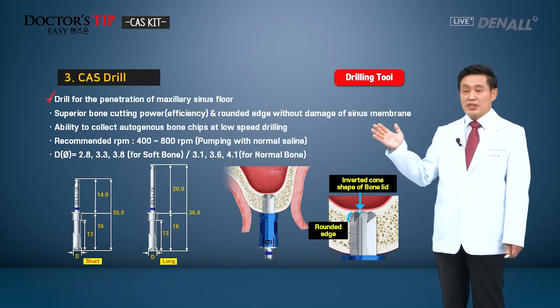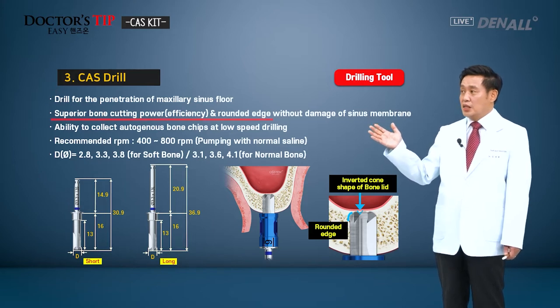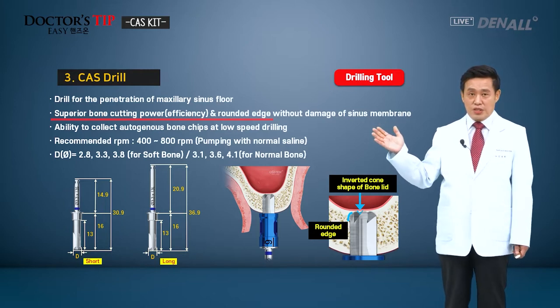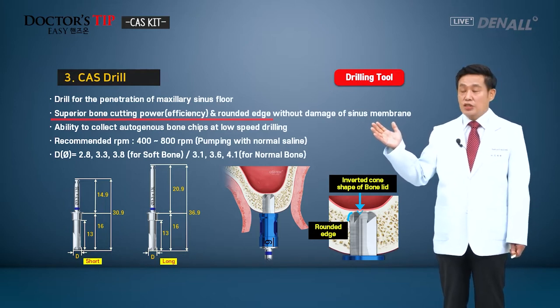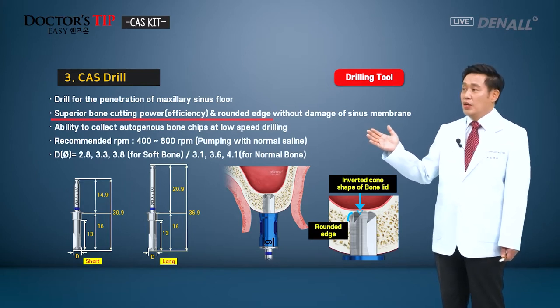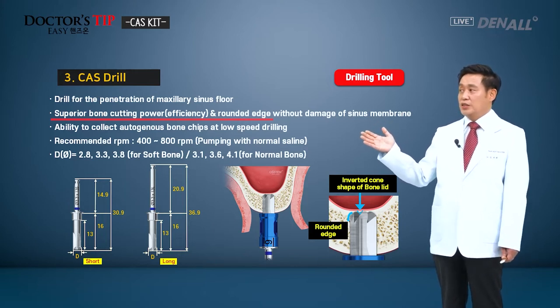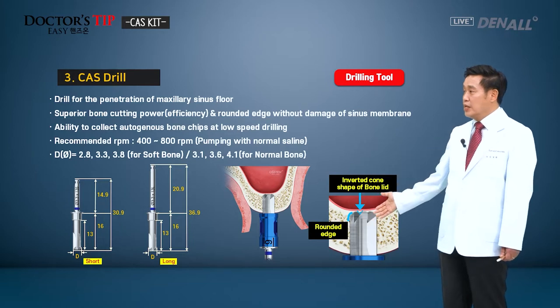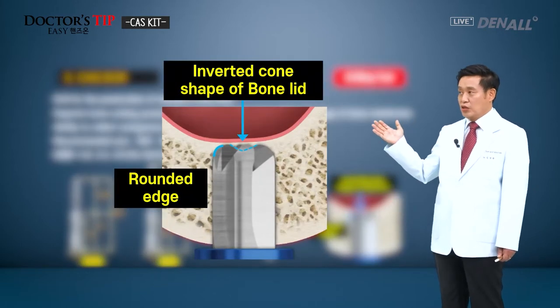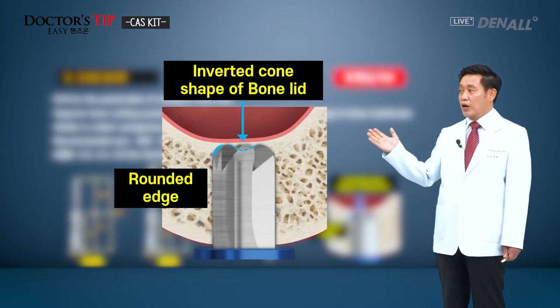The CAS drill is basically designed to penetrate into the maxillary sinus floor. As I said before, its edge is rounded and has very good cutting efficiency, so without damaging the sinus membrane, you can penetrate into the sinus floor. That's how it is designed. At the top, it has the inverted cone shape of a bone lid, which is designed to minimize the damage to the membrane.